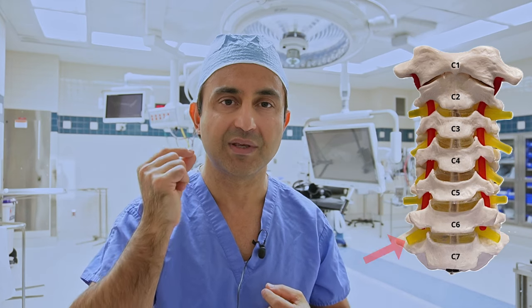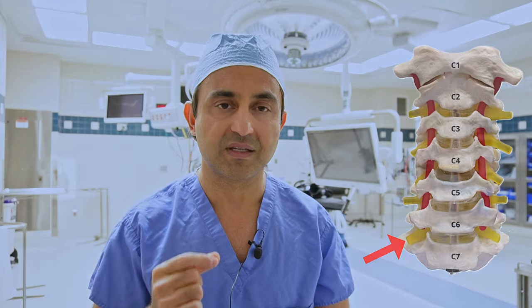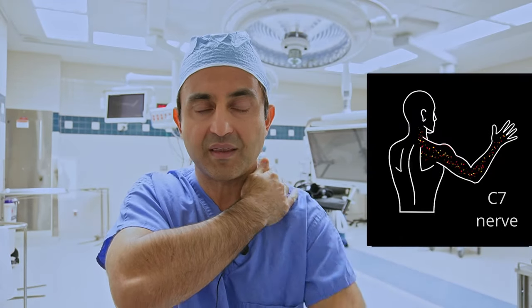Today I'm going to show you the case of a patient who had a pinched nerve between the C6 and the C7 vertebrae in the neck, pinching the C7 nerve. The C7 nerve comes out of the neck and goes all the way down into the forearm and the hand, and can cause severe pain, numbness, and tingling. So without further ado, let's get started.